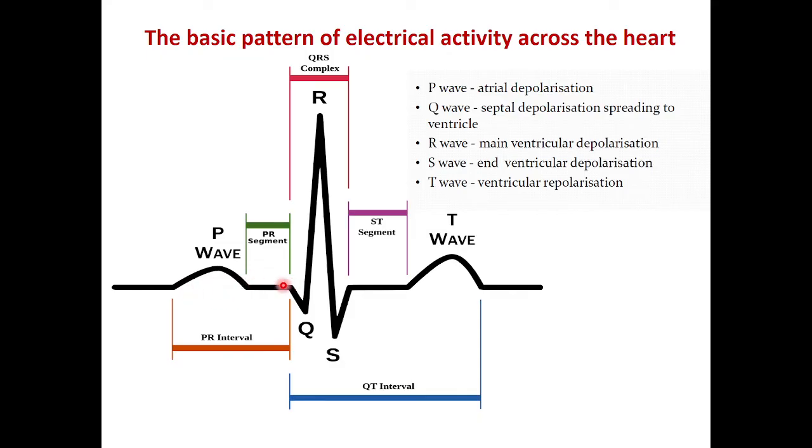So this is the period between what? Between the delay, the wave will be received by the AV node from the sinoatrial node. So it is the time between the conduction of the action potential from the sinoatrial node to the AV node.